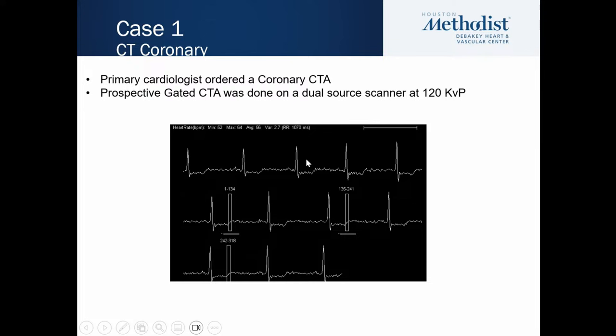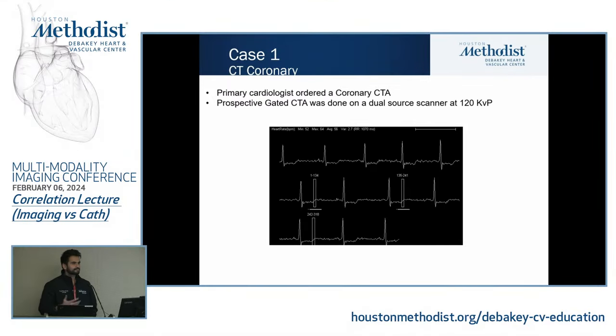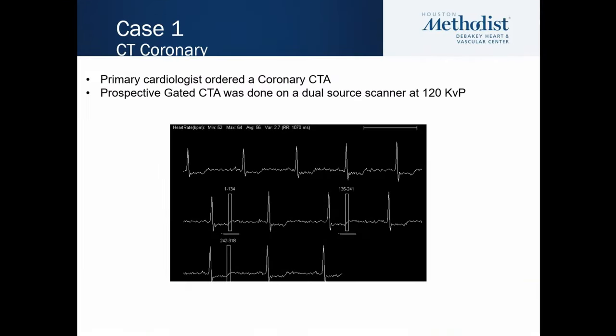This was mid-systolic imaging. So Anish, what does the manufacturer, Siemens, recommend for scanning this patient? The manufacturer would recommend scanning in end diastole, late diastole. For any heart rate less than 60, the best odds you're going to have is diastasis. Also, the coverage of the whole scan is 5 centimeters. That's essentially why they end up scanning this patient.